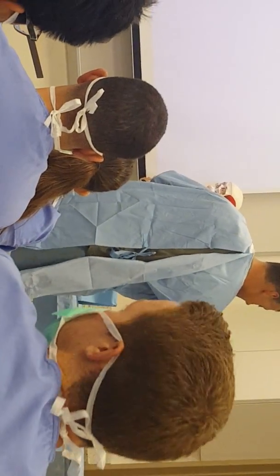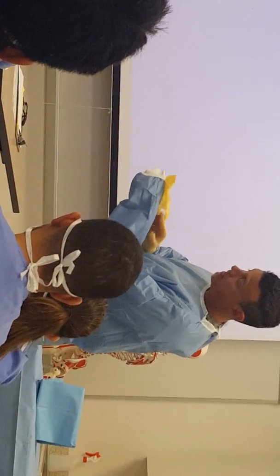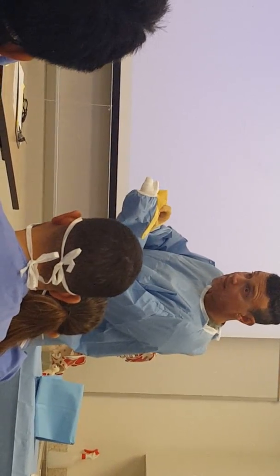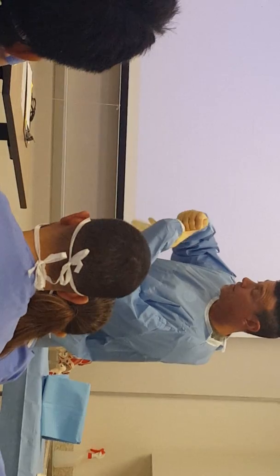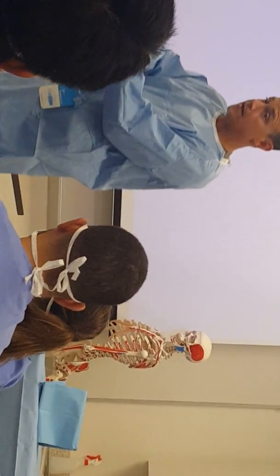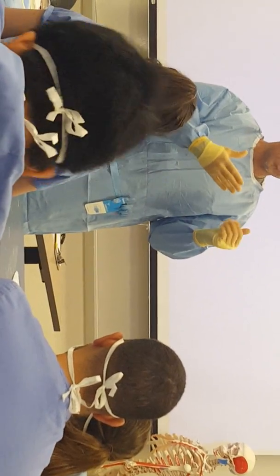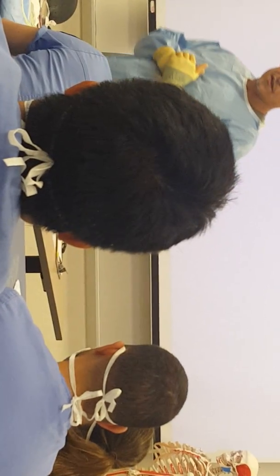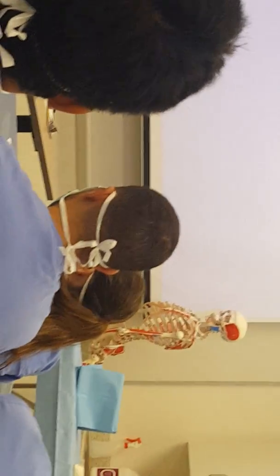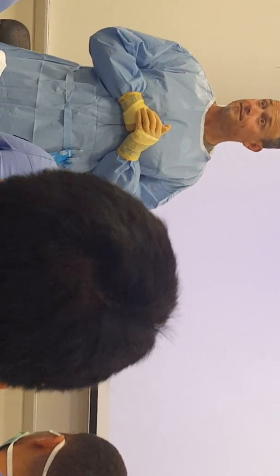Now that I have one, it's a little easier to grip the other one. Again, slow motion here. On the inside, my index and my thumb, I'm grabbing that cuff. See how it works? Taking the other side of the cuff. Got it? Piece of cake? It's already molded inside itself a little bit. Yes. That's why I gave you guys sterile gloves, so that you can practice opening them up. Since none of your gowns are packed in a way that it needs, you can't practice that part until you're up here. He's the only one that gets to practice that. That was it. You got yelled at twice.